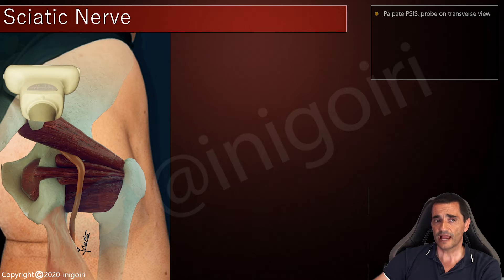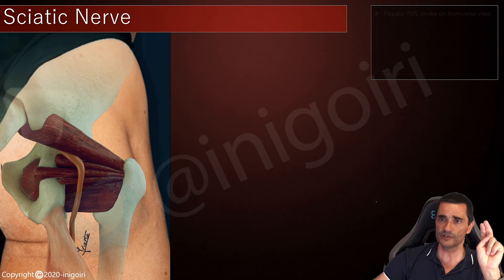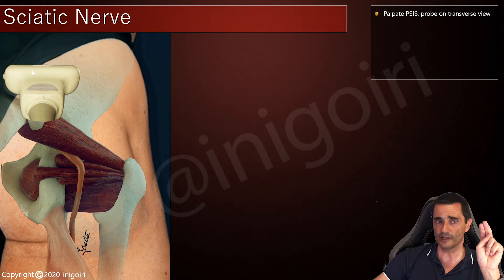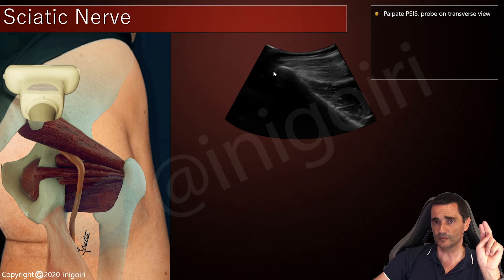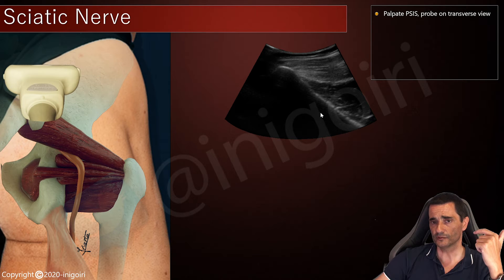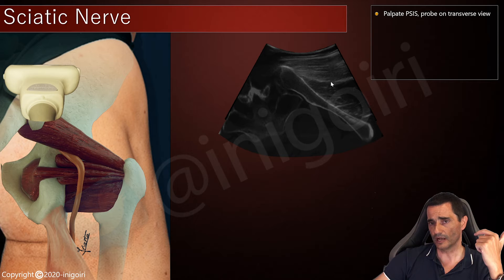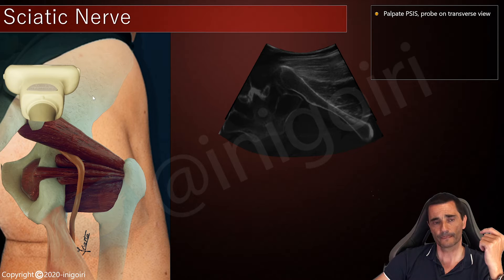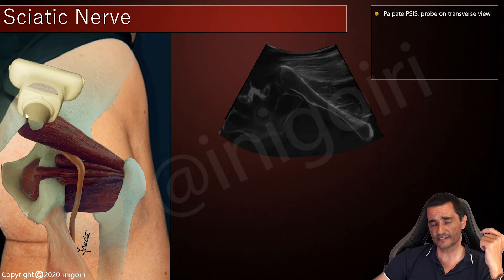To locate these structures, I highly recommend beginning by palpating the posterior superior iliac spine and placing the probe over this bony landmark. We will obtain this image with the posterior superior iliac spine, and this cortical must be very clearly seen — this is the iliac bone. This will be the gluteus maximus and this will be the gluteus medius. Very important to have a good view of this cortical. I've put a CT image over the ultrasound image to think about the structures we are just about to see. This is the iliac bone as you can see. Then, we know the piriformis muscle has this angulation and orientation, so we can turn the probe about 15 degrees to achieve a good orientation when checking the piriformis muscle.